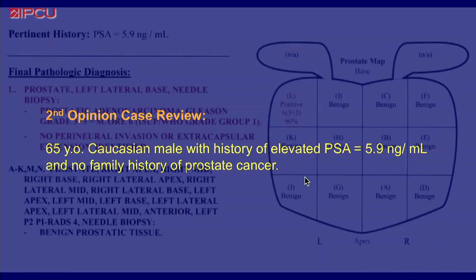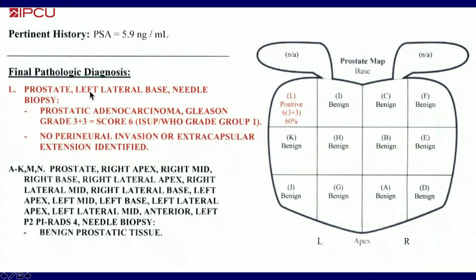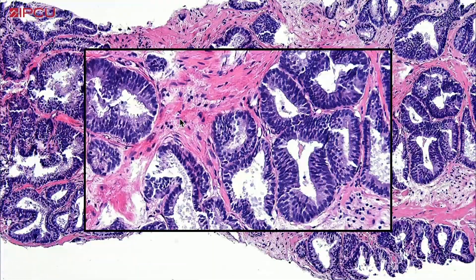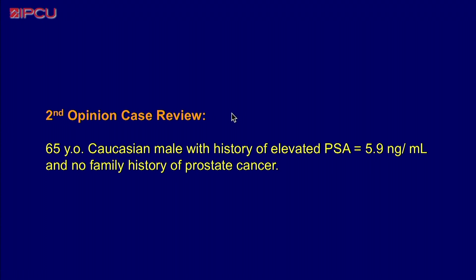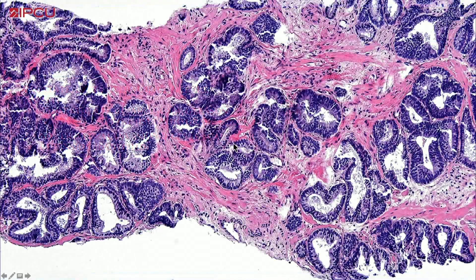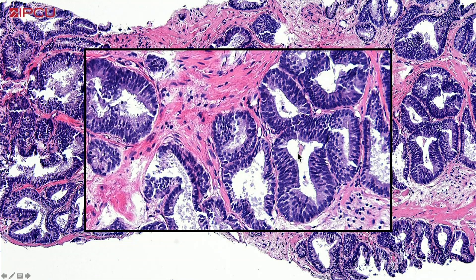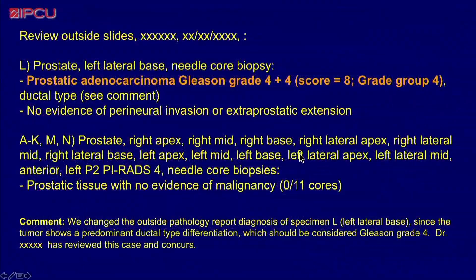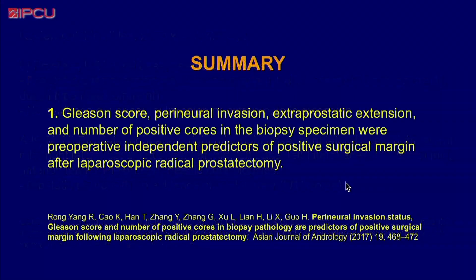Finally, this example just came to our practice for a second opinion a week ago. We had a small focus of 3+3, with a PSA of 5.9 ng/mL, in a 65-year-old Caucasian male with a large prostate. We reviewed it, and while we may be confused with individual glands resembling Gleason 3+3, this is actually a ductal adenocarcinoma — it's a 4+4. So from grade group 1, this patient was upgraded to grade group 4, with significant consequences for treatment.